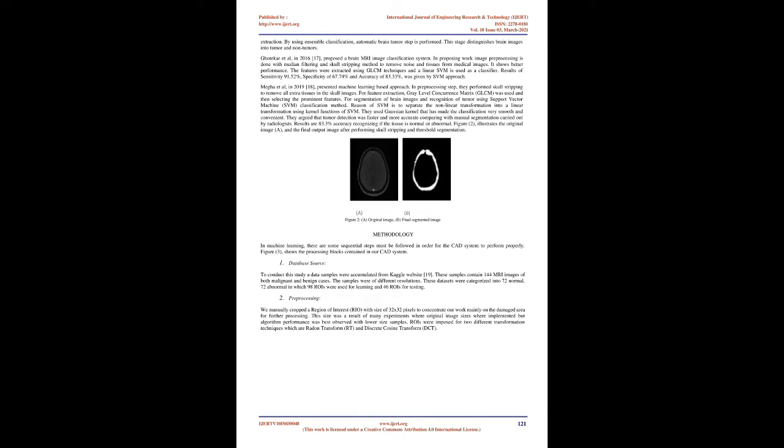Literature review. Aranitha and D. Siva proposed a random forest classifier system-based brain tumor detection and segmentation method. For eliminating and detecting noise in the brain image, an adaptive median filter is used. Via texture features, features are extracted from the denoised brain image, such as inverse difference moment, IDM, variance, inertia, angular second moment, ASM, energy, dissimilarity, and homogeneity, that are acquired from the gray level co-occurrence matrix, GLCM.